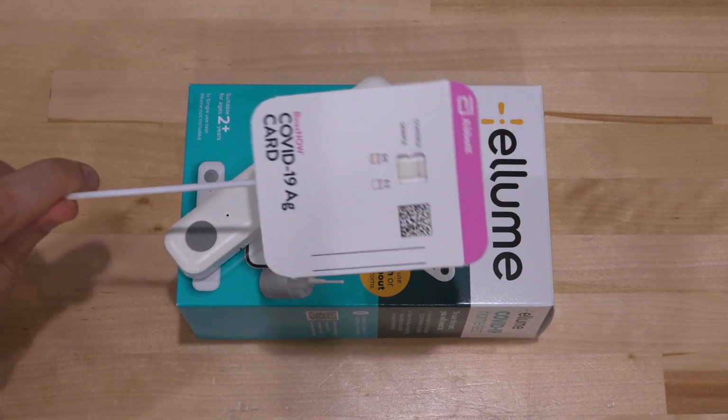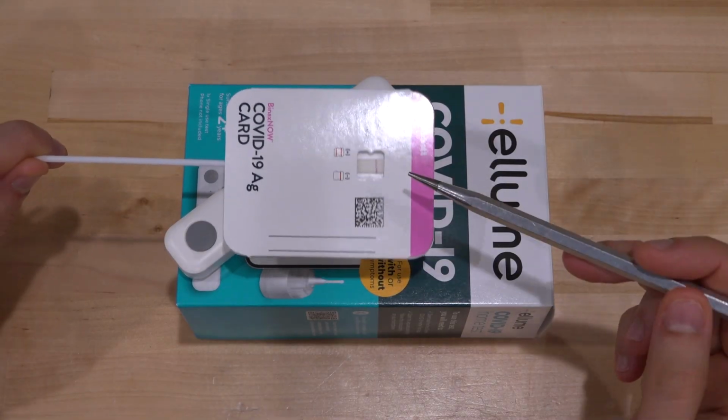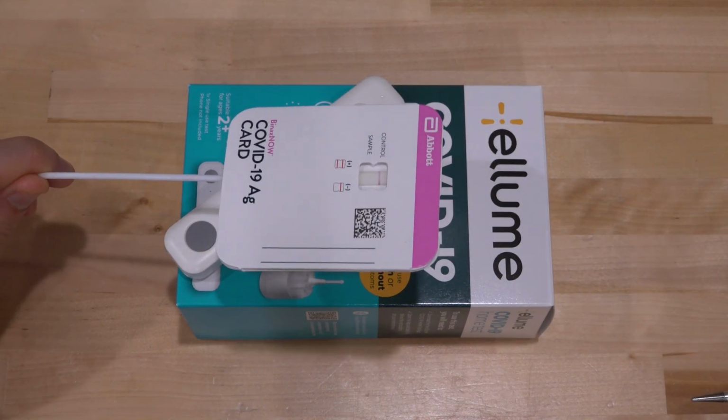I also did one of these. This is essentially exactly the same test, antigen-based, and if there's two lines, you kind of have COVID, and if there's one line, you don't. And I used this afterwards, and this one, of course, came back negative.